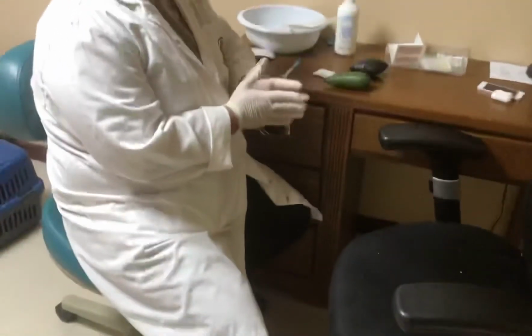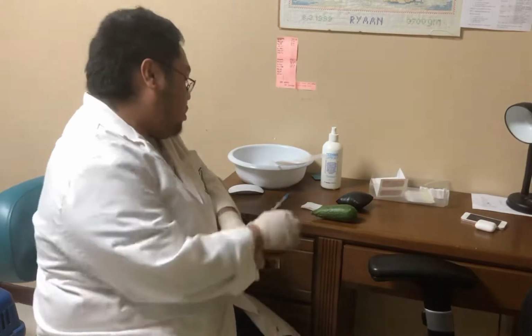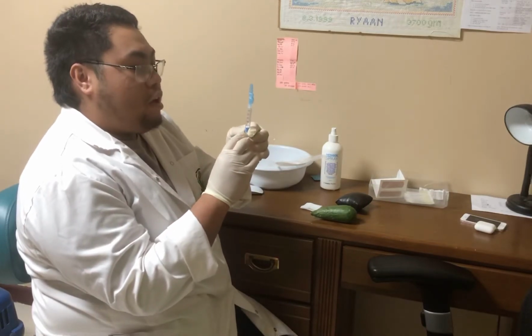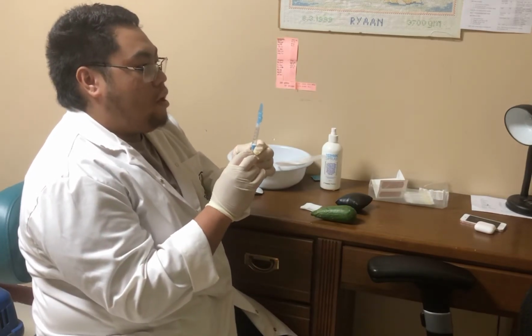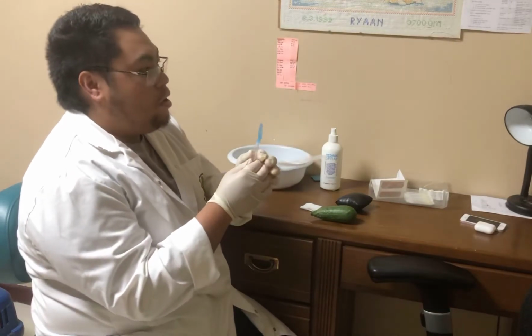So after successfully extracting the blood sample from the patient, make sure to hold the syringe upright, expressing any air bubbles, because those air bubbles can alter the results, as I said earlier.